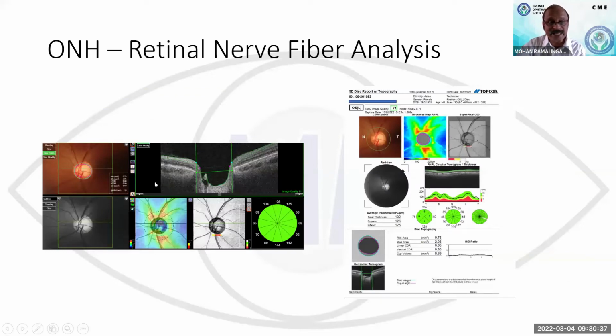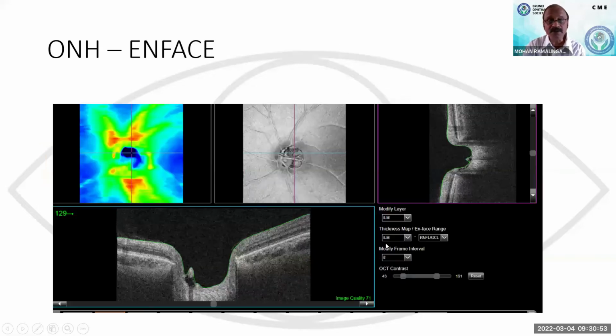And it can dissect the optic nerve head. I can see the cup, I can see the vessels, I can see the retinal layers closer to the optic nerve, and it gives all the parameters of the optic nerve head. And these are all the other facilities available. I can move this cursor from the top of the optic nerve to the back. So now this is the choroidal circulation, where I can see the choroidal vessels, which can get affected in certain diseases of the optic nerve head.